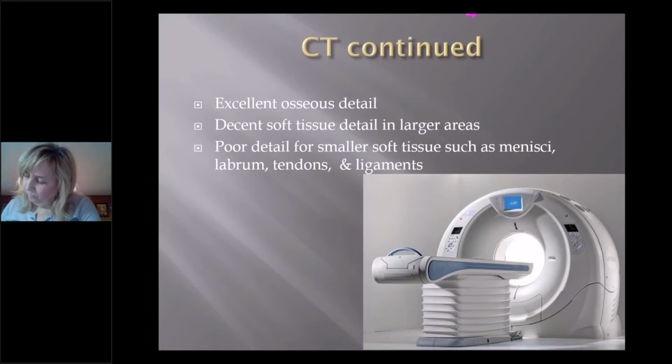So hopefully that gives you a little better idea on CT in terms of application and utilization. When you look at a CT scanner, I threw just a picture of one down there. They have a nice big open gantry and it's narrow. The patient basically lays on the table and slides into it, and it moves back and forth.